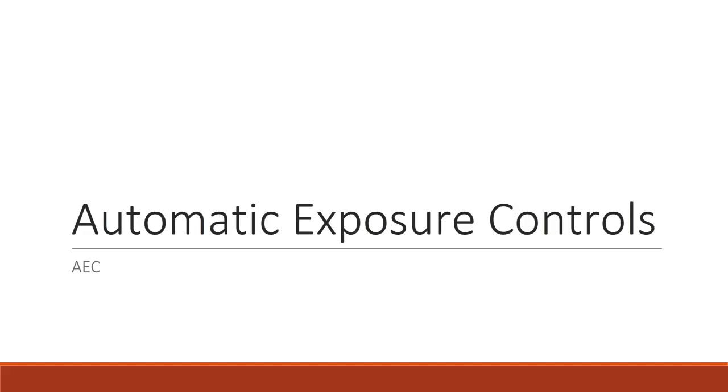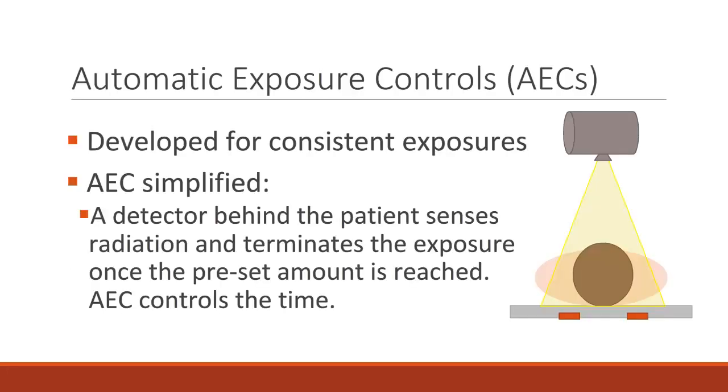In this video, we will discuss automatic exposure controls, what they are, and how to use them wisely. Automatic exposure controls, or AECs, were developed to produce more consistent exposures, reduce repeat exposures, and decrease patient dose.